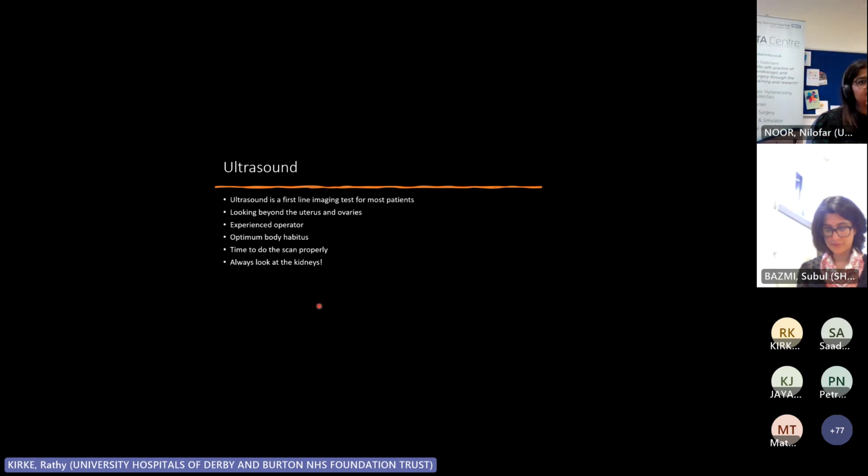You need someone who's really experienced with ultrasound, because when somebody learns to do ultrasound, they obviously learn to look at the uterus, the endometrium, the cervix, the ovaries, where everything is, and then they start moving on to the dynamic assessment. The other problem we have with ultrasound is people are getting larger. So the larger they are, the more intra-abdominal fat, the harder it is to make that assessment.